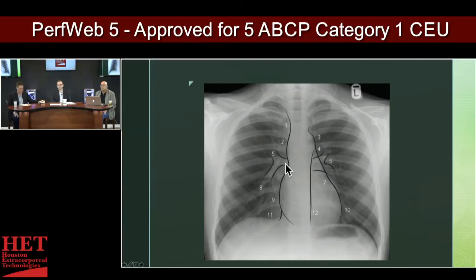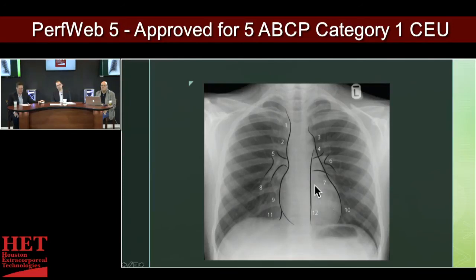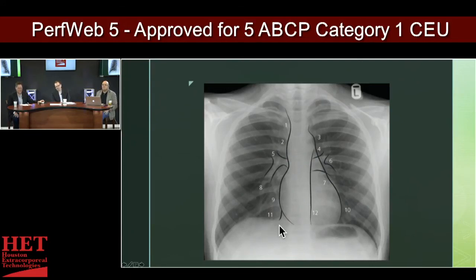Number two is the right atrium. We have the right ventricle, and we have the left ventricle — which is number nine. These are the pulmonary arteries coming off the heart. And the inferior vena cava.